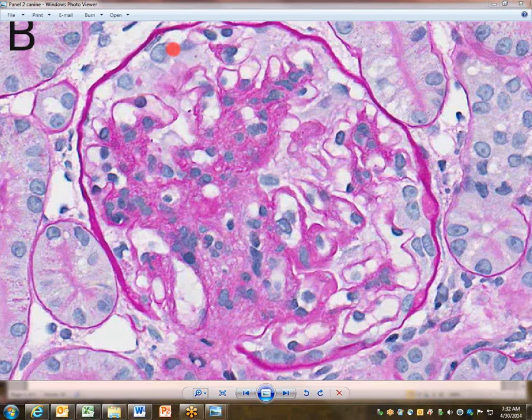We do have some hypertrophy and almost like foaminess of the podocyte cytoplasm. Again, podocytes often get activated and reactive for many reasons. So both the mesangial cells and the podocyte prominence are somewhat nonspecific. In addition to the mesangial hypercellularity, you have too much mesangial matrix. The fact that I can fit three of these dots in there is too much mesangial matrix. It should be very fine, delicate, and lacy.